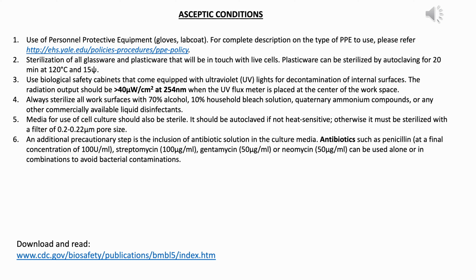In a few labs, people also use antimycotic solutions, especially if there is any person working with yeast nearby. Then it is very good to have antimycotic solutions also, because they will prevent fungal contaminations. One such solution is amphotericin B, which is used at 0.25 microgram per ml. Another is nystatin, used at 20 microgram per ml. You can also buy a combination of penicillin, streptomycin and amphotericin B as a PSA combination, an antibiotic-antimycotic combination. So these are various methods through which one can prevent contamination within the cell culture and maintain aseptic conditions.